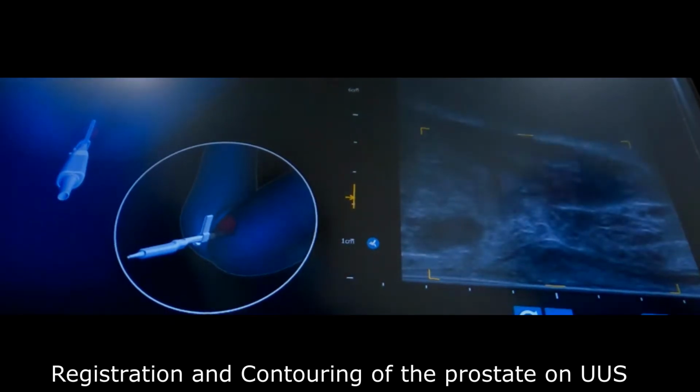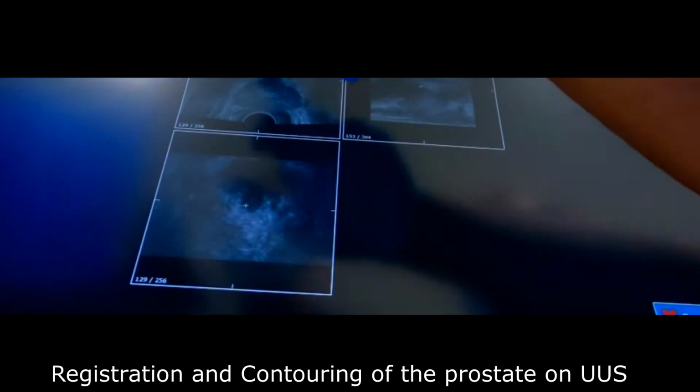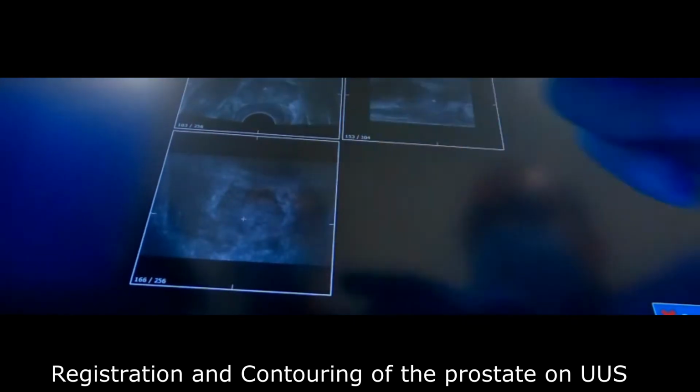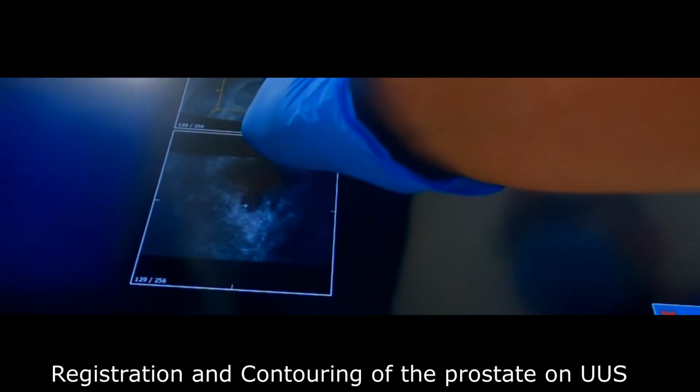Contouring and registration of the prostate gland on the ultrasound images allows the fusion. The fusion process occurs between the ultrasound and MRI images.